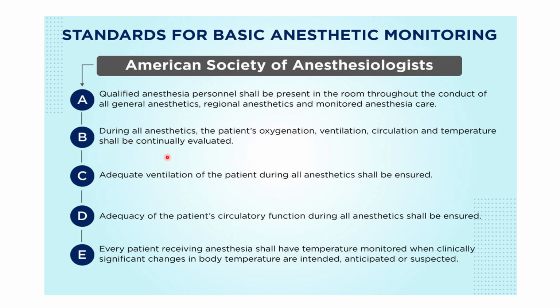Which are the standards during all anesthetics? During the conduction of anesthesia, the patient should be continuously evaluated for oxygenation, which is to provide oxygen for the patient; ventilation, which is to eliminate CO2 and avoid retention of carbon dioxide; circulation, which detects heart rate and blood pressure; and temperature, when you suspect that the patient is having violent body temperature changes.